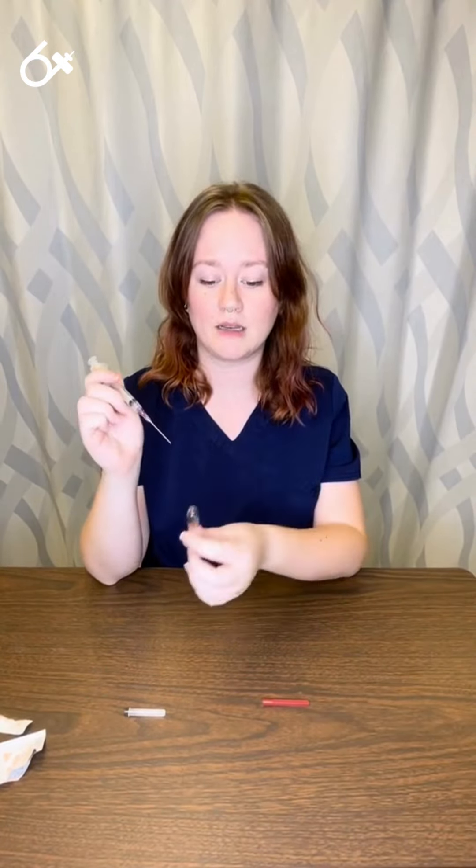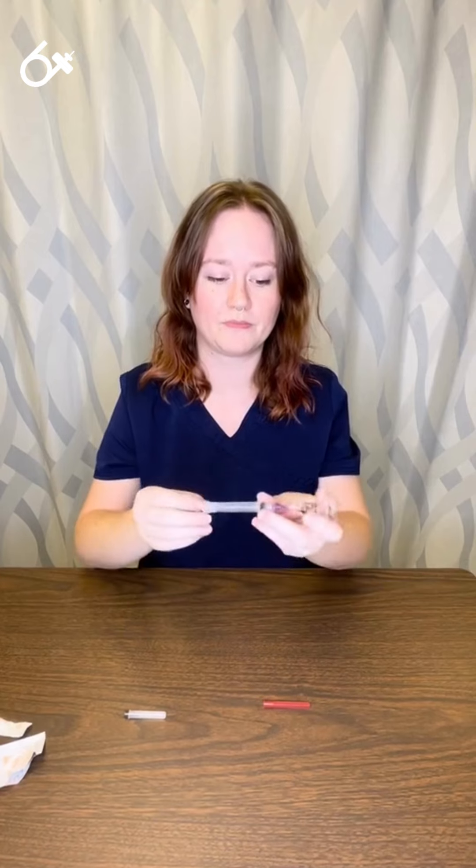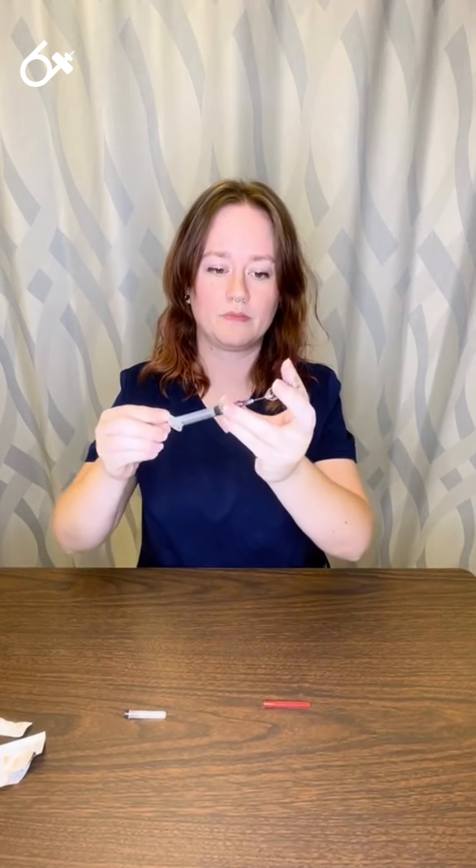I can insert the needle and withdraw it while the ampule is sitting on the table, or I can insert the needle and invert to withdraw my medication. Like so.